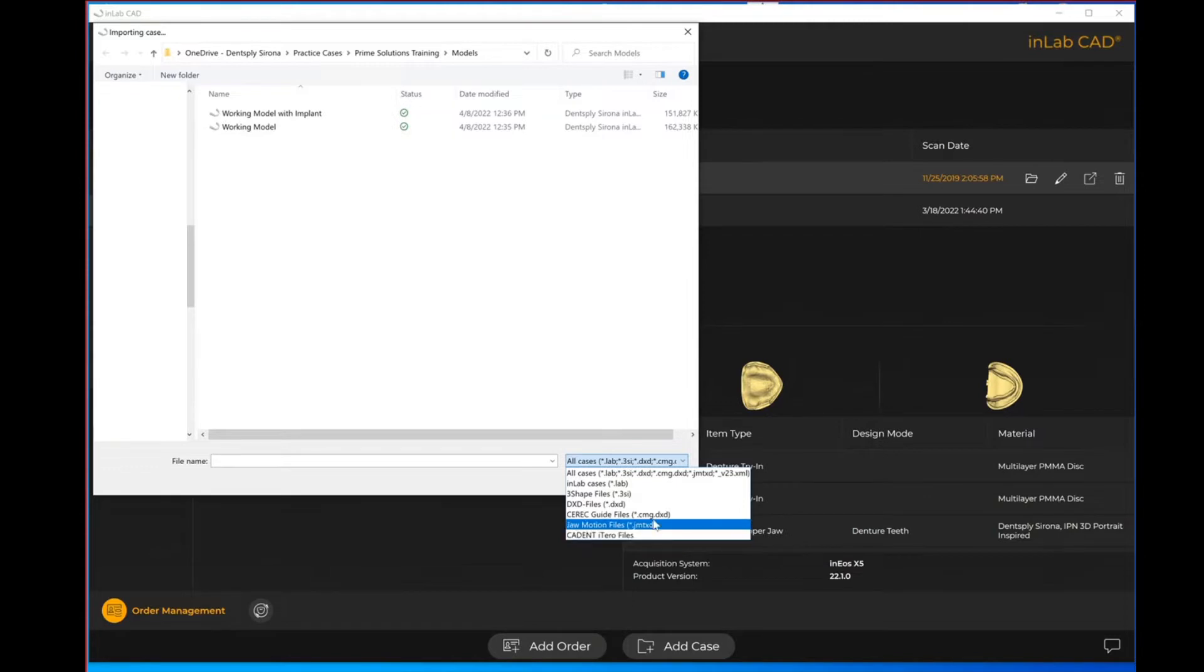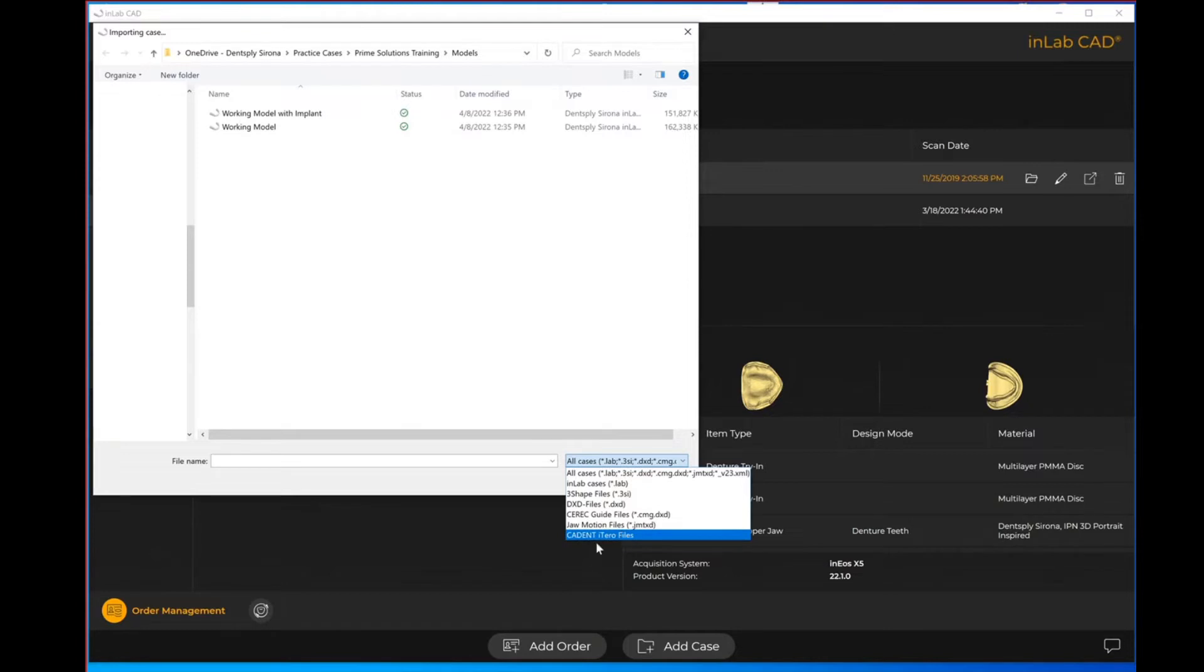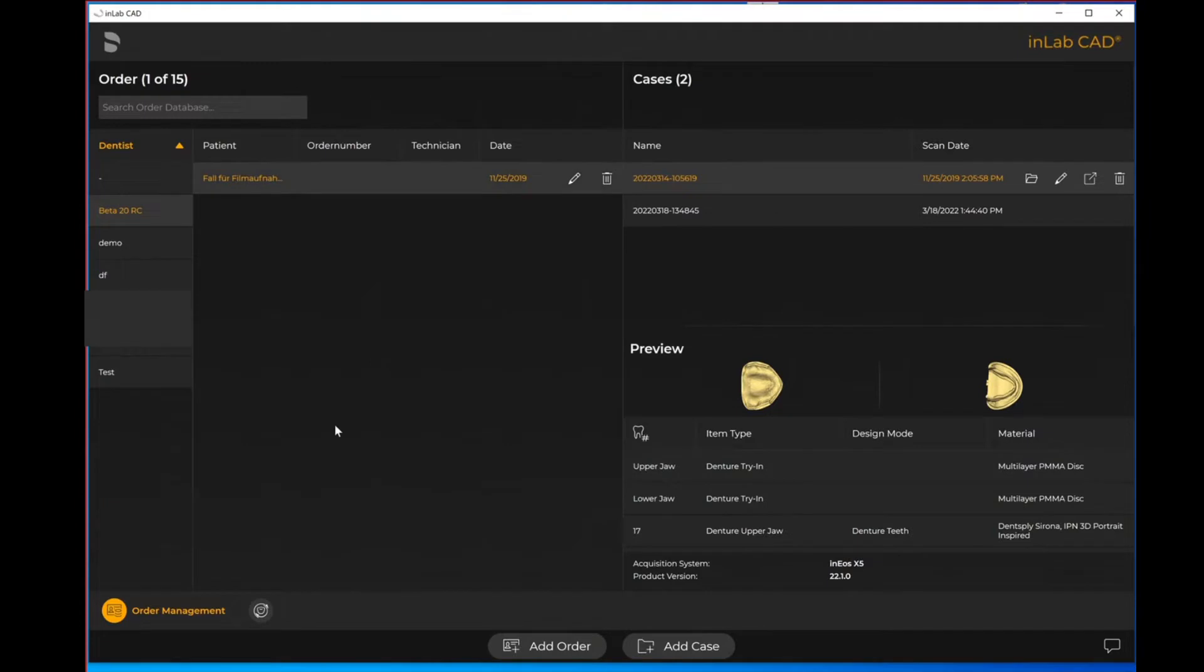In addition, a jaw motion file as well as a Cadent iTero file. However, when you will notice that in that import option tab there was not the STL file, and that is because when you are importing an STL file you do actually have to first create a new order.